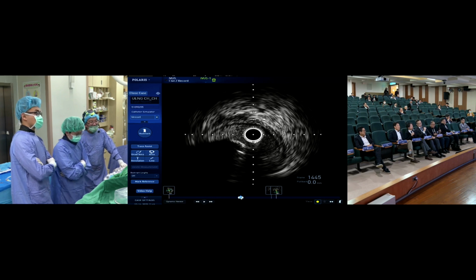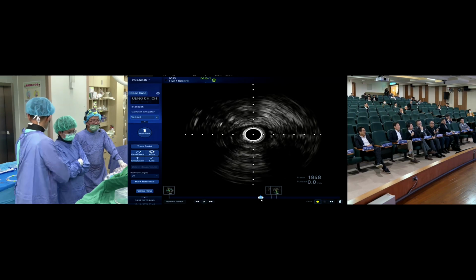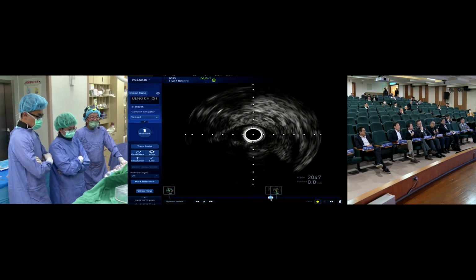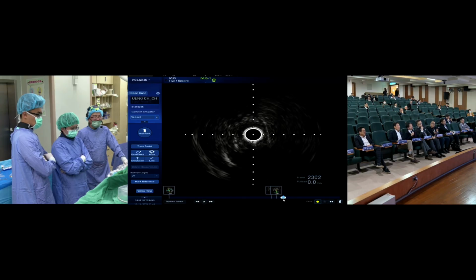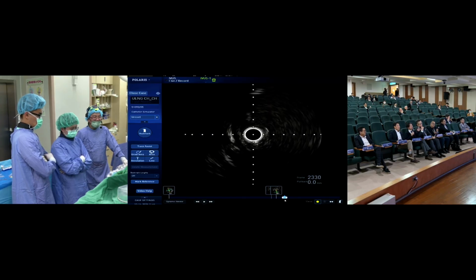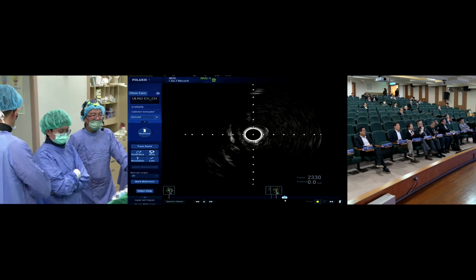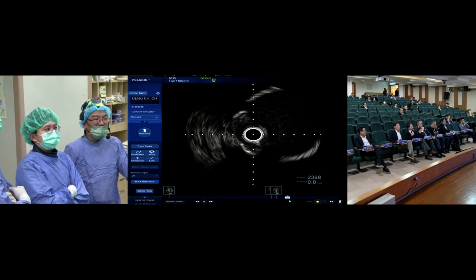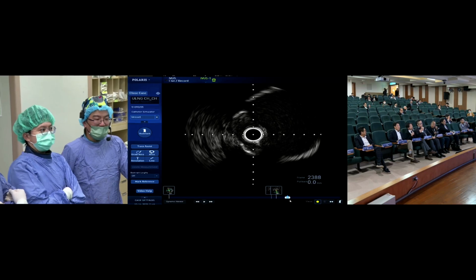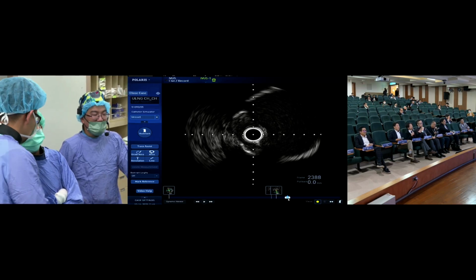Dr. Zhong, the guide wire is already crossing. You should proceed with your procedure, the balloon angioplasty. You checked the IVUS, and the guide wire is passing the subintima, right? But maybe you should put the stent proximally to keep the patency. IVUS also tells us the vessel diameter is much bigger, 7 or 7.5, nearly 8.